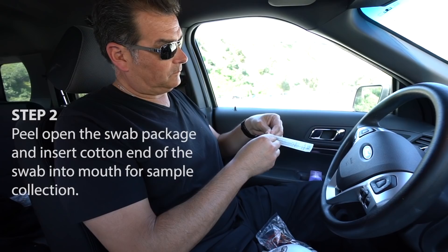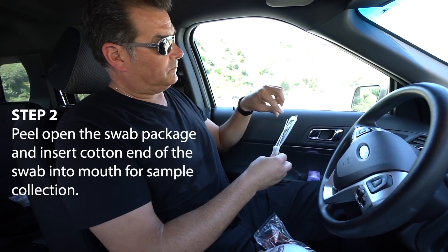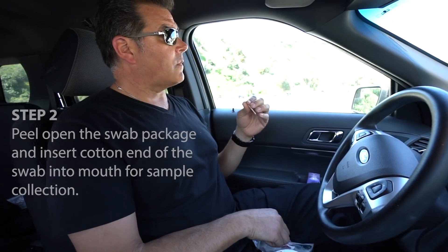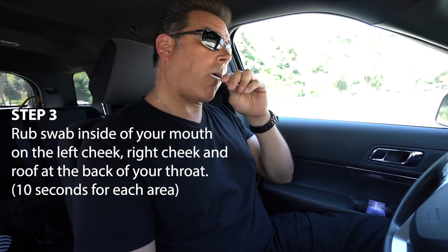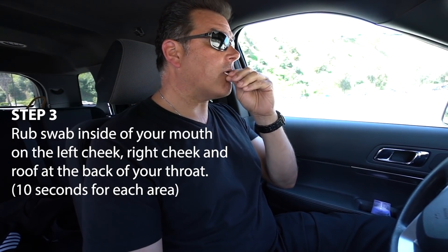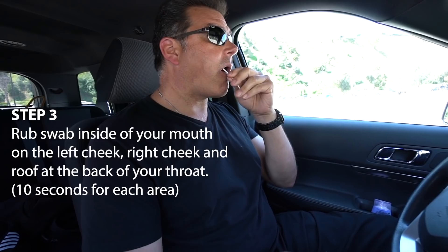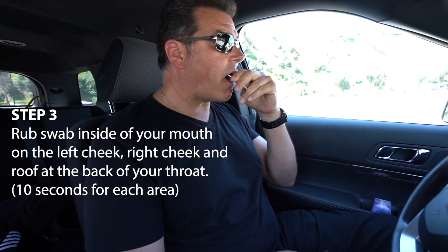Step 2: Peel open the swab package, remove the swab, and place the cotton end directly into your mouth. Step 3: Rub the swab inside of your mouth on the left cheek, right cheek, and roof at the back of your throat. Do this for at least 10 seconds on each side to ensure the swab collects enough saliva for the test.